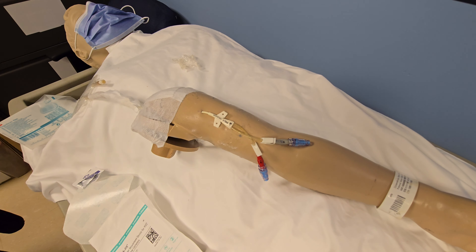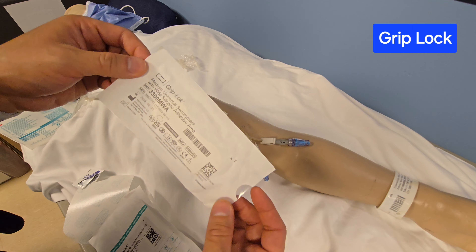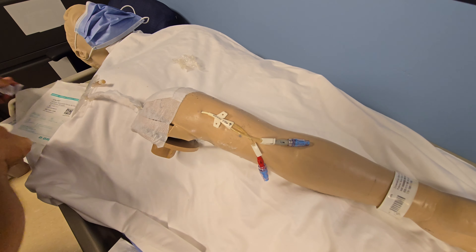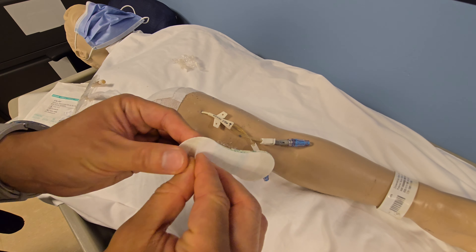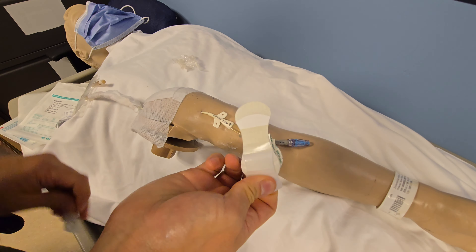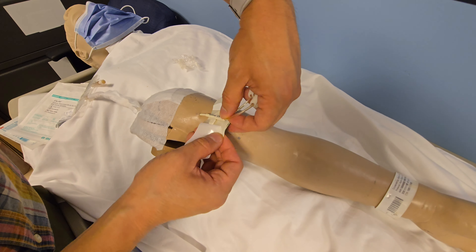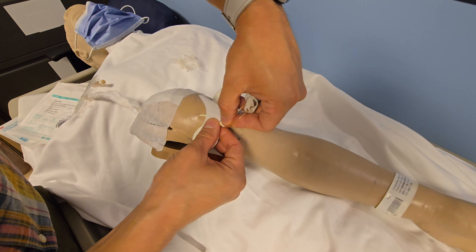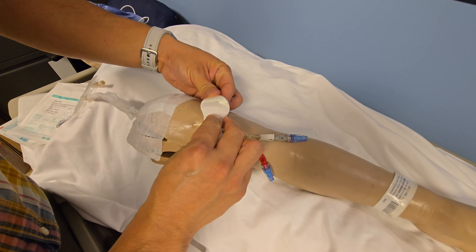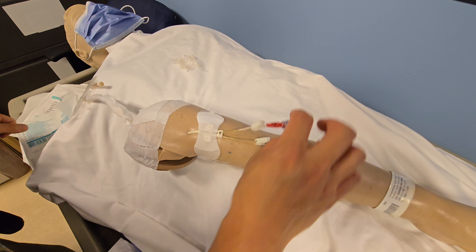Lastly, I'm going to show you the Grip Lock. You may have seen this one — it looks very similar to Foley catheter securement devices, and you'd be correct. This is just a smaller version for central lines. Same principles apply: clean the site with chlorhexidine. When you open it, peel from here and pull — all the adhesive is underneath. You're going to place the hub — not just the line, but the actual hub — in the middle, because that's where it gets the most grip. Once that's done, peel the wings one side to the other, then apply a Tegaderm film to cover it and change per organization policy.